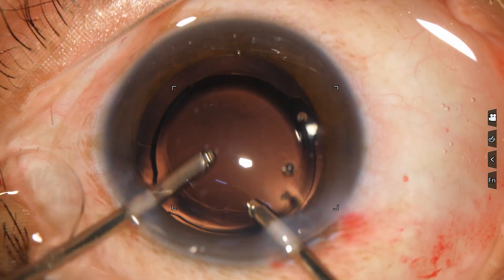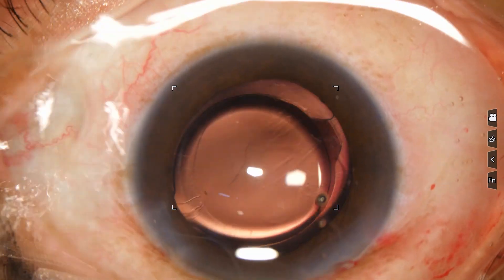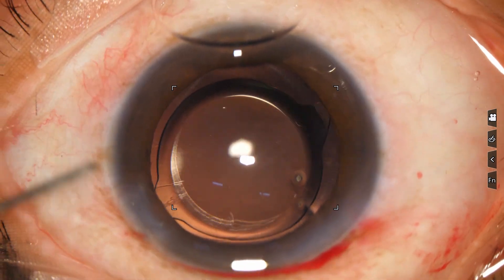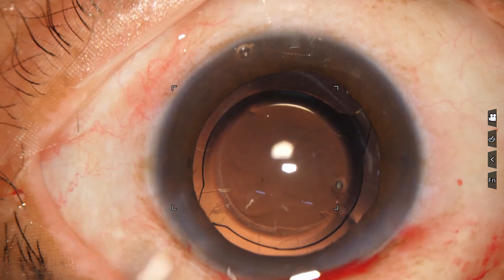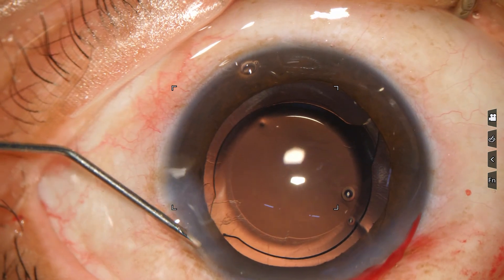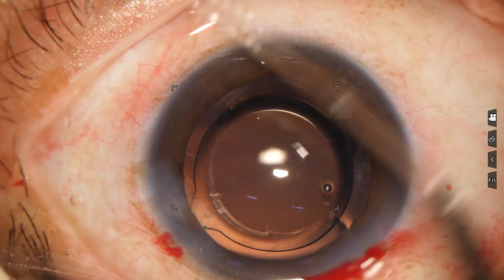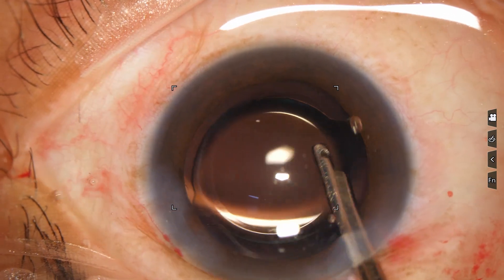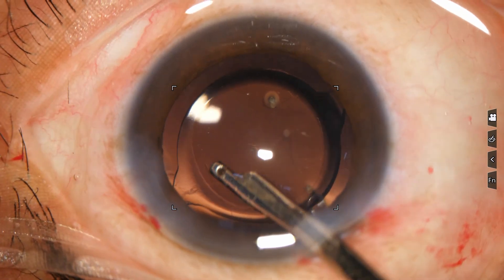If we lift off the anterior wall of the main wound, leakage of fluid is less and the anterior chamber depth can be maintained nicely. This is closure of the side port — the side port must be closed with stromal hydration. The final lavage of the anterior chamber removes the viscoelastic that sticks to the corneal endothelium.